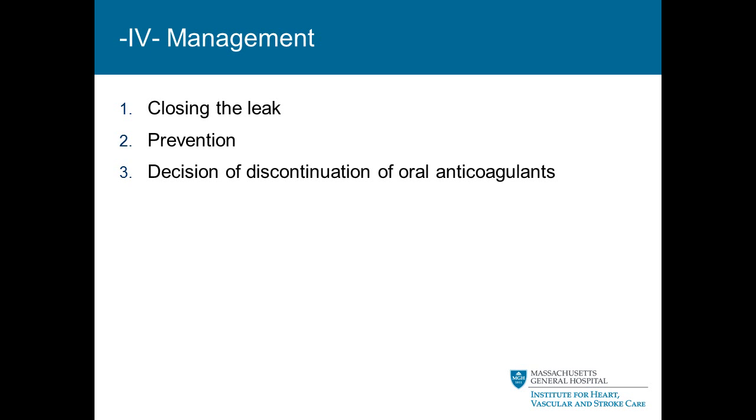So what to do about it? Here are the things that this can be managed with. One is closing the leak. There is no data on this. There are a couple of cases that Dr. Carr had closed. We heard about one earlier where he closed the leak with a coil or some other devices, but this is not performed on a wider, larger scale.